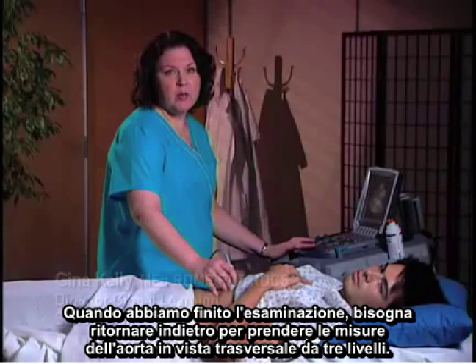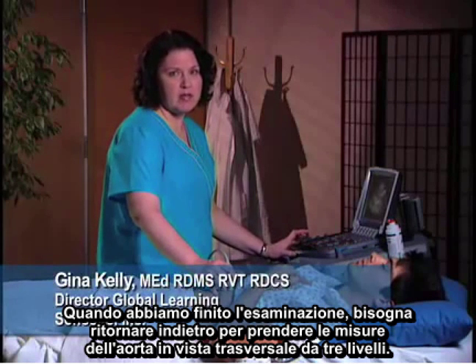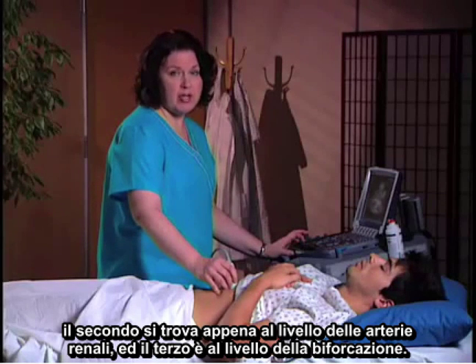Once we've done the survey, we want to go back and take measurements of the aorta in a transverse view in 3 levels. One level is proximal, above the level of the renal arteries. The second is just at the level of the renal arteries. And the third is at the level of the bifurcation.